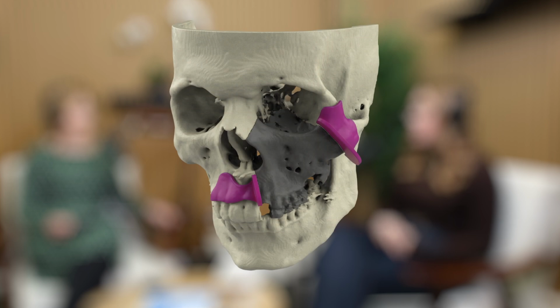They will give me the patient details, what they need for that patient, how I can help, and then I'll go away, work on the planning, and then throughout they will pop back, see if they approve of the plan, if they're happy, and then it can go back to them. If not, we can change, and then it will all get printed, and then I also can go to theatres as well and see the actual surgery happen. So that also allows us to get feedback on whether what we've done is working, and if we need to change anything for future cases, we can implement it straight away with the surgeons telling us there and then what's good and not good.